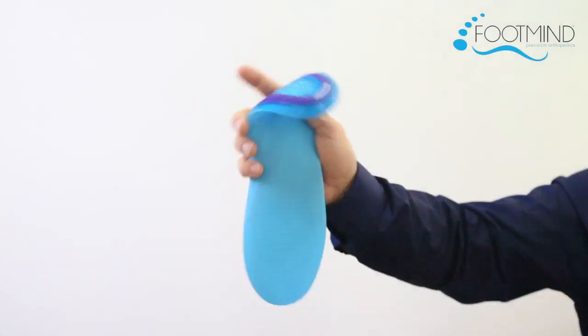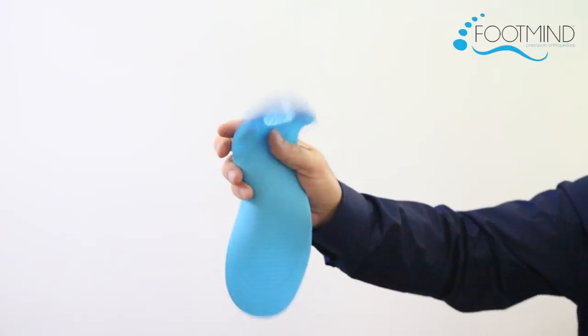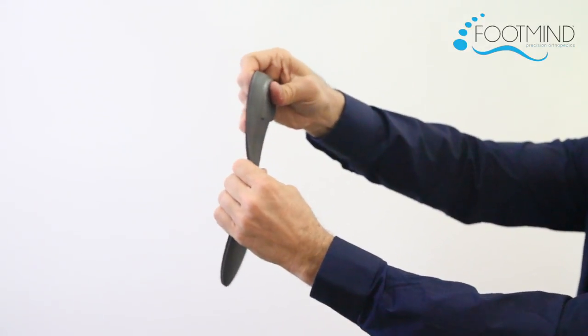Currently on the market, you have two options: flimsy with no structure or corrective features, or a stiff plastic carbon fiber that feels hard and unyielding. Through proper use of materials, Arches Orthotics have achieved the perfect balance of comfort and stability.